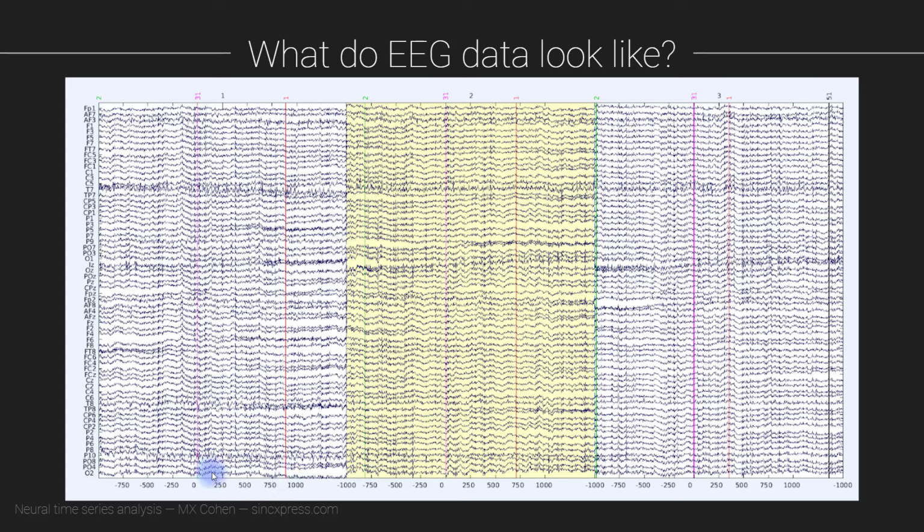In this case, this happened at around, let's say, maybe 900 milliseconds, so it's a little bit under a second. Here you see the same marker, 31. It appears again at time 0, and here the marker 1 happens at around, maybe, 700 milliseconds. So the picture was on the screen, but now this individual pressed the button a little bit faster on this trial compared to this trial.